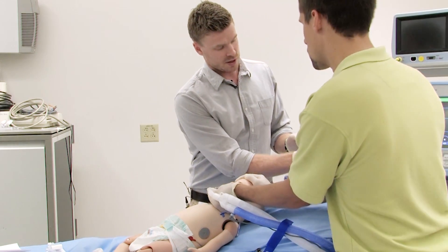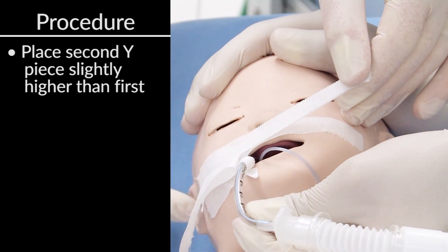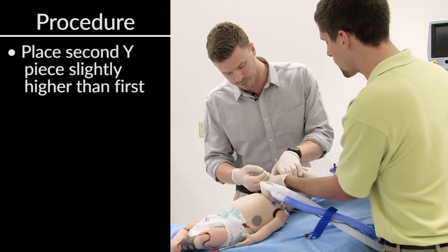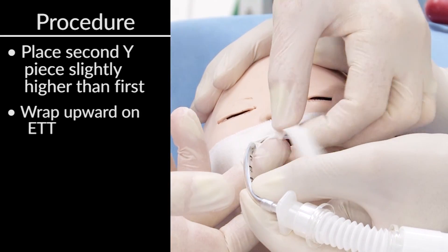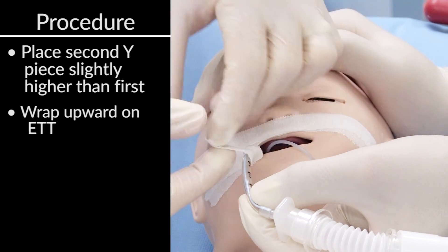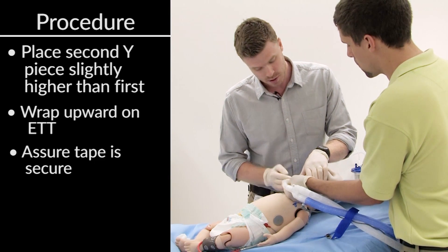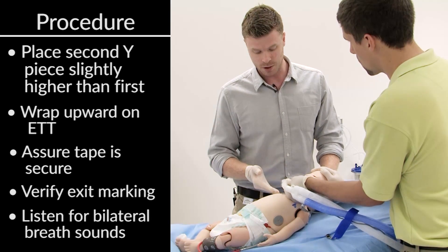That looks good. I'm going to take our second piece of tape — the second Y — and do the same thing, going just a little bit higher with the second piece of tape so I'm covering a little bit more skin. On the other side of the cheek I'm going to go just a little bit higher as well to cover more skin and make this a little bit more secure. The only difference between the first piece of tape and the second is that with the second I'm going to wrap it up like a candy cane, coming all the way up the endotracheal tube, with a little tab. Press it down and make sure everything is fine. You can double check visually to make sure the exit marking is correct. We're going to listen to breath sounds and make sure we hear them bilaterally, and our job is done.